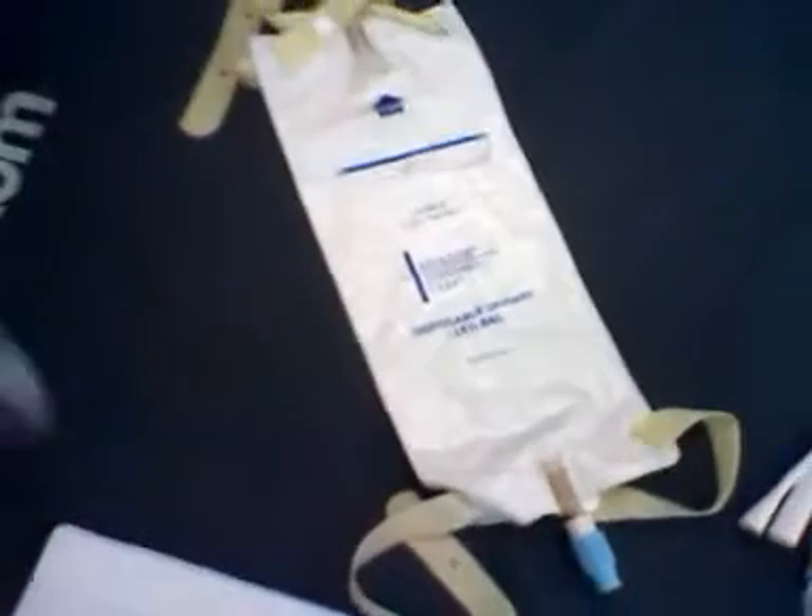What's the difference between these? Fecal collector, right? Fecal collector. Didn't you say rectal? That's a rectal bag — it's for fecal. It's a fecal collector. Same thing, huh?